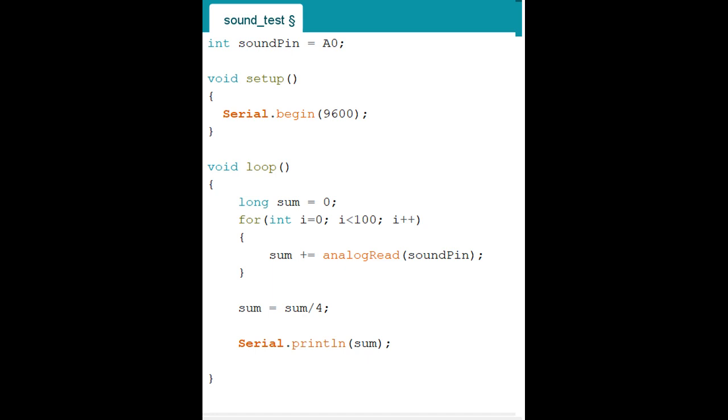I try to space it out. I like to space out things because it's easy to read. But if you want to condense it down, go ahead and write right away. Just write void space setup, open parenthesis, close. What does that mean? It's like, hey, I'm going to call it setup, which is kind of the rule of programming. I have to set up something, and then parenthesis means I'm going to write something below.